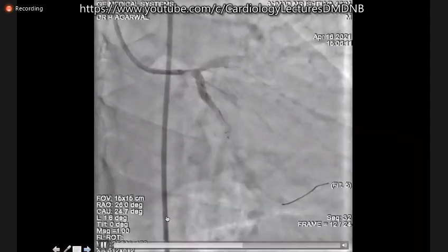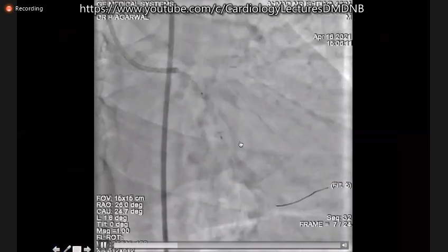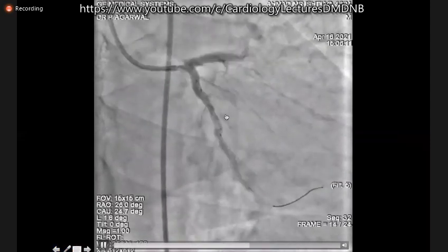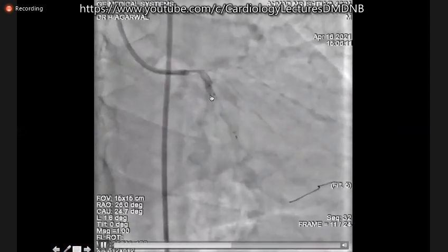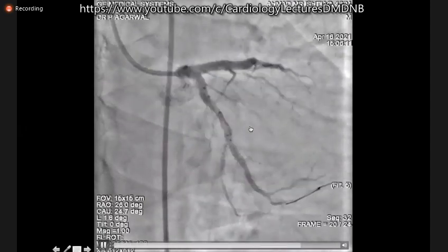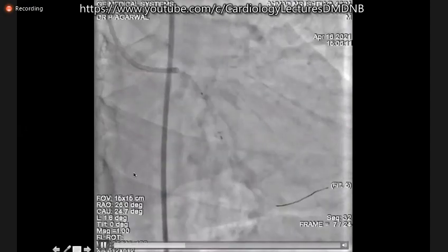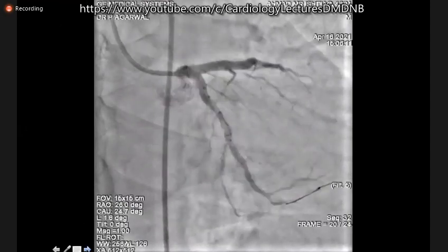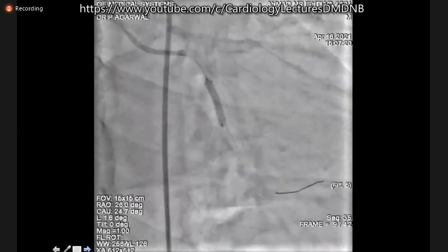And a very peculiar picture is about, see, this device, these markers, and as you also, Deepak, mentioned, about 1.2 millimeter of the scaffold is outside. And this marker is just 0.1 millimeter ahead of it. Means this is a very well matched balloon to the scaffold. So you can really go high pressure without any problem, right? So I deployed my stent at, say, about maybe 14 atmospheres.